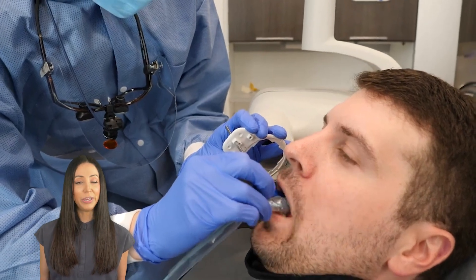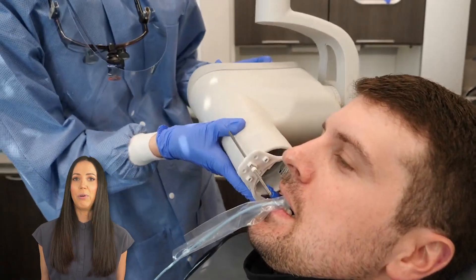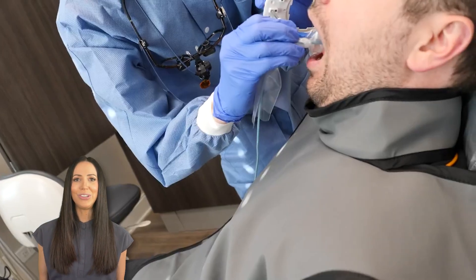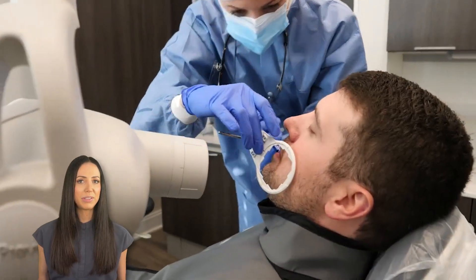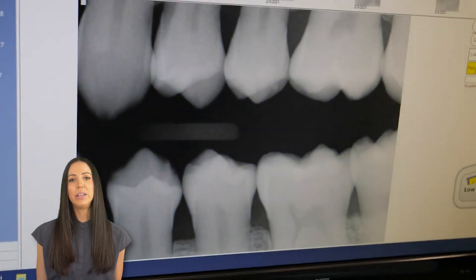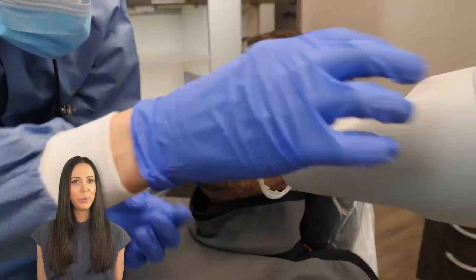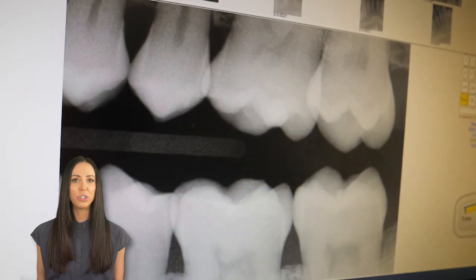Here we are setting up for the bite-wings. We are using the XCP rings again, but sometimes a tab without any rings is used instead. The bite-wings are usually taken routinely by themselves, but they are also included in this full mouth series. The bite-wings specifically help to screen for cavities and tartar between the teeth, as well as help examine the level of the bone that holds your teeth in place.